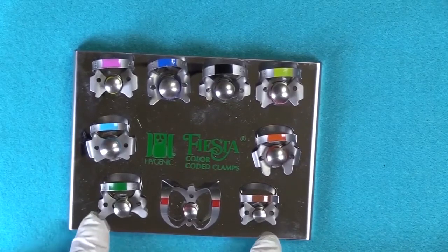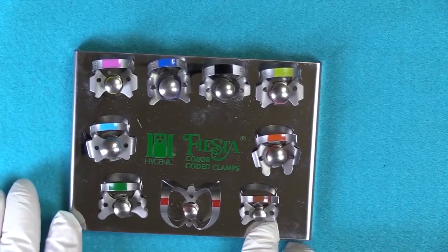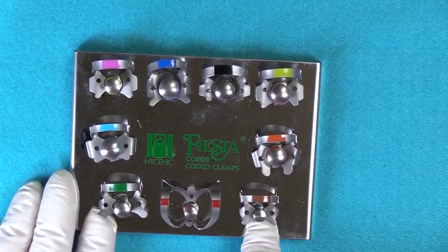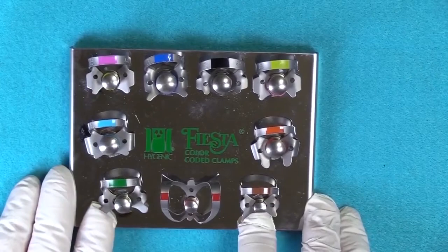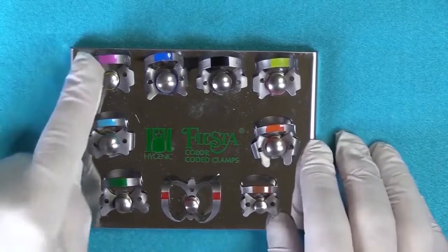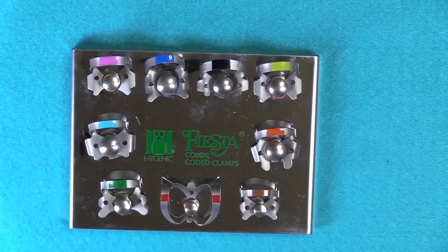The 2A's jaws are a little bit structured to go subgingival. So if you have a bicuspid where it's questionable whether you're going to get the clamp to stay on, the 2A would be the appropriate one to select. And then the rest of them, the molars, are, as I mentioned, the flat-jawed clamps.